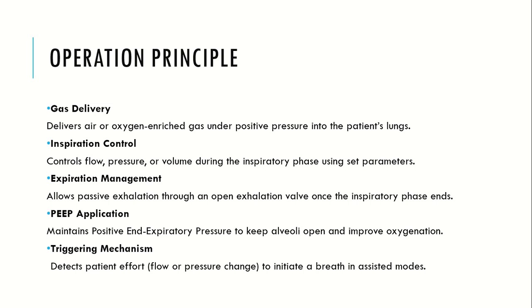In the triggering mechanism, it detects the patient's effort, that is the flow or pressure change, to initiate assisted breaths in assisted modes.